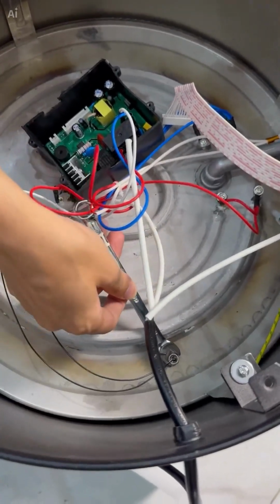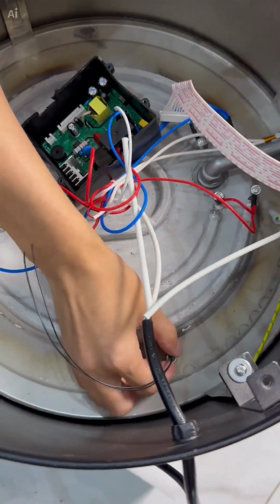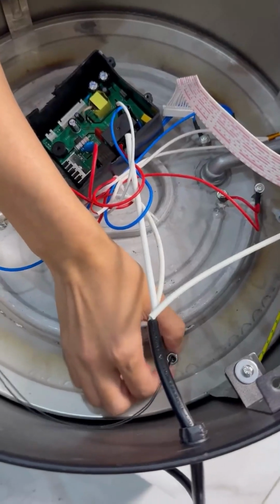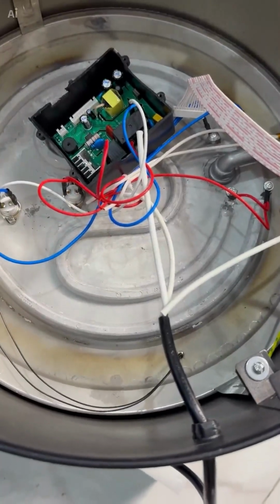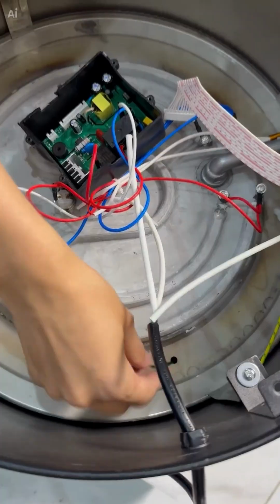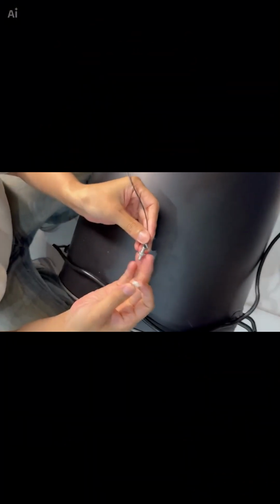When it's loosened enough, we can use our hands to unscrew it. This one. Okay. Then take this off and remove the nut. Then just put this down and it's done. Next, we need to replace this temperature probe.